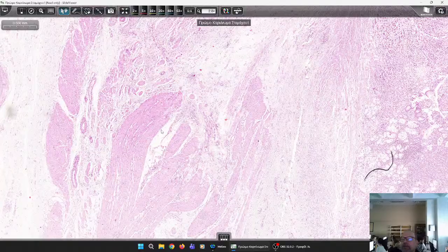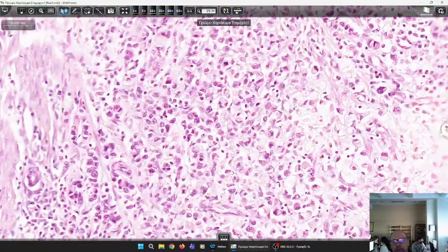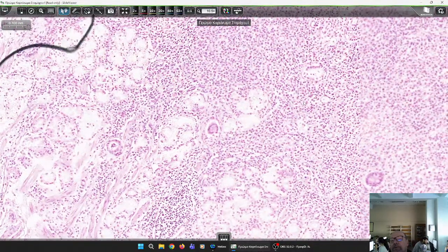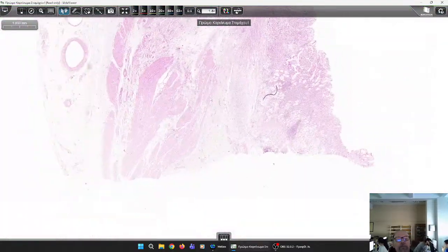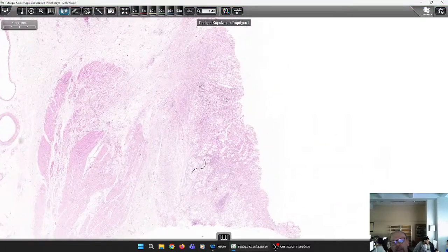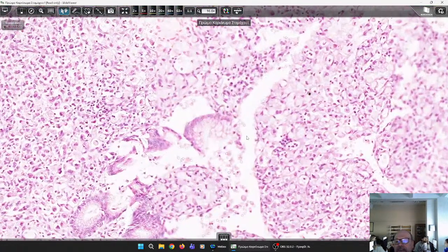And this is such a carcinoma which, despite its poor differentiation and poorly cohesive type, which is frequently accompanied by E-cadherin immunonegativity in the carcinomatous cells, has a tumor-free muscular layer, and this may permit quite a good survival rate. So this is early gastric cancer.